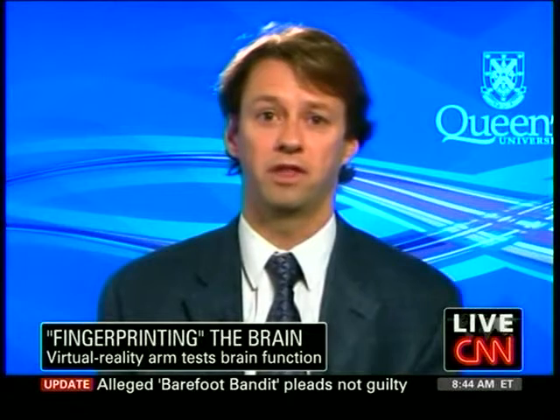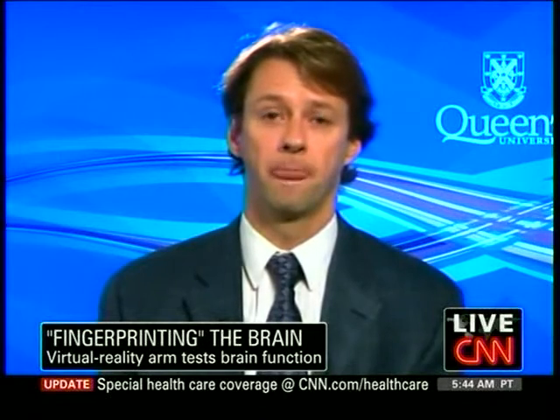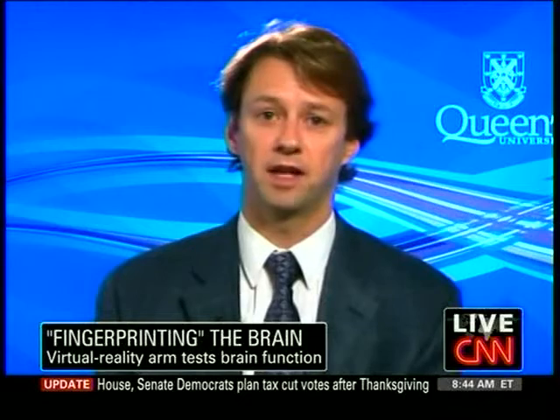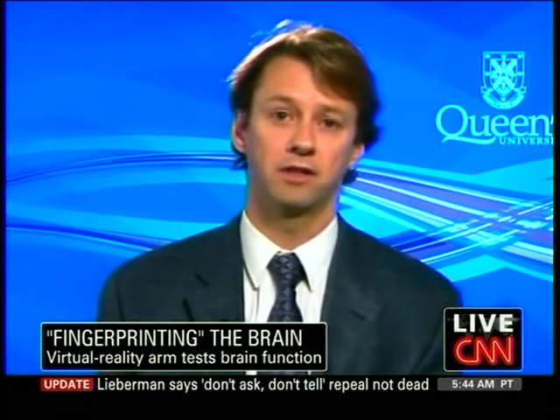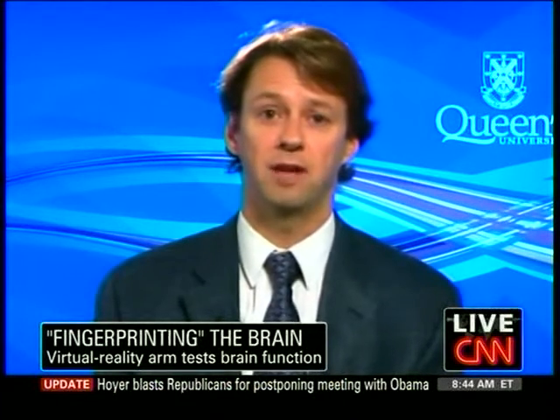Traumatic brain injury is a very hot topic right now with the military situations in Afghanistan and Iraq, as well as concussions in sports. And it's very important to get fast, rapid information, and it's important that it's objective. It doesn't matter where you have the test done. That's the nice thing with the robotic technology, is it doesn't matter if you're in LA or New York, you're going to get the same number.